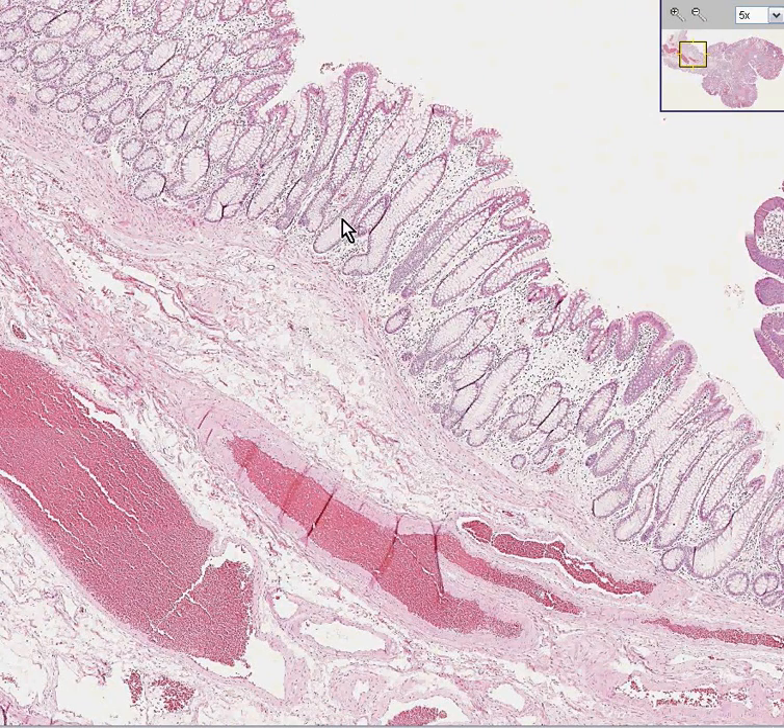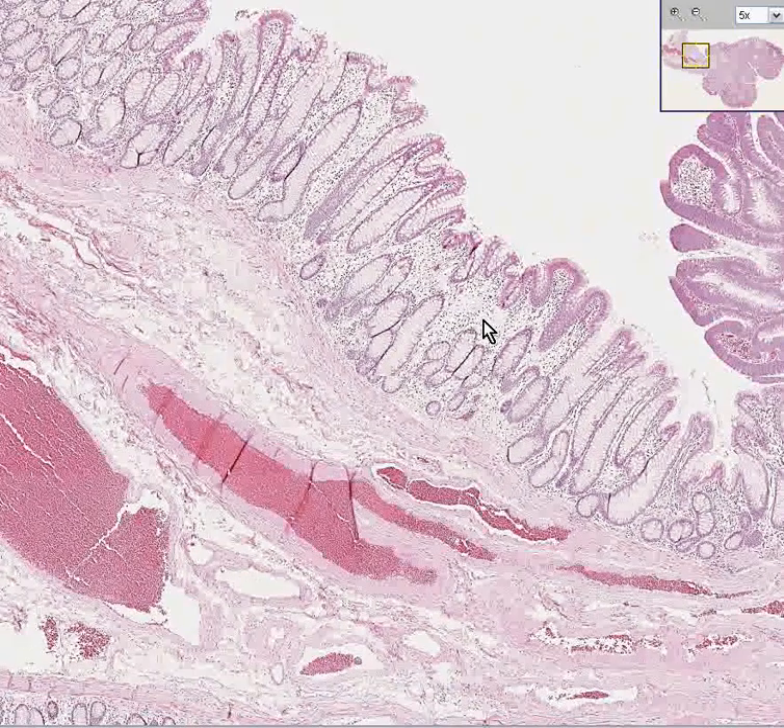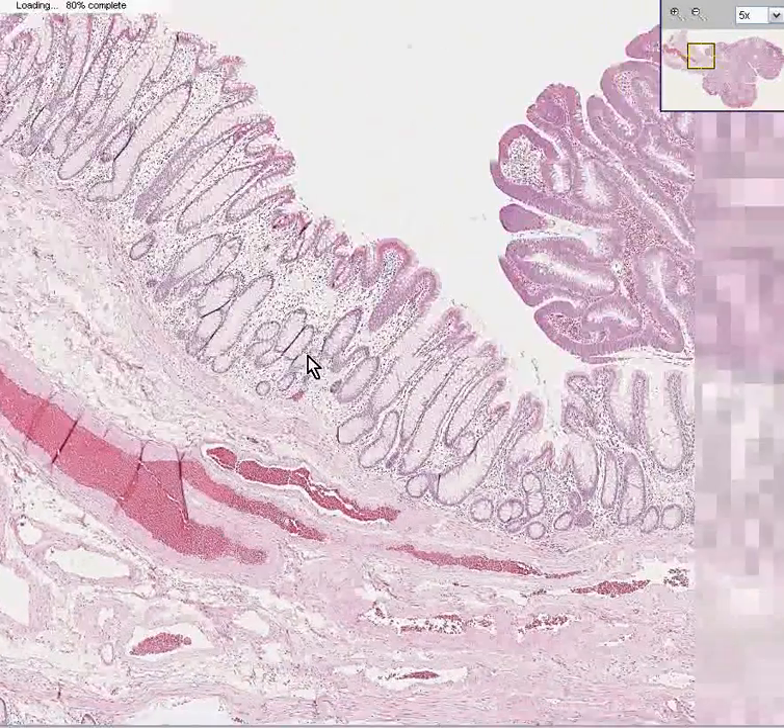Notice how the glands are chiefly mucinous. Notice how the nuclei right here are at the base — and they're at the base over here too. Notice there's a nice uniform cell population with loose connective tissue in the lamina propria.